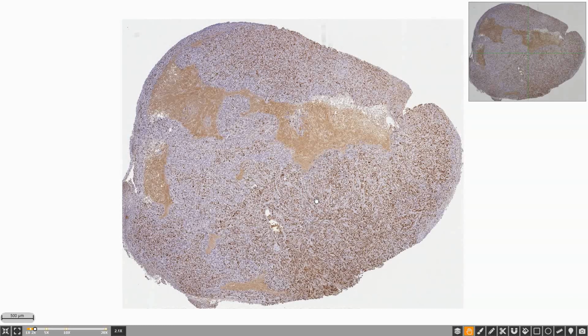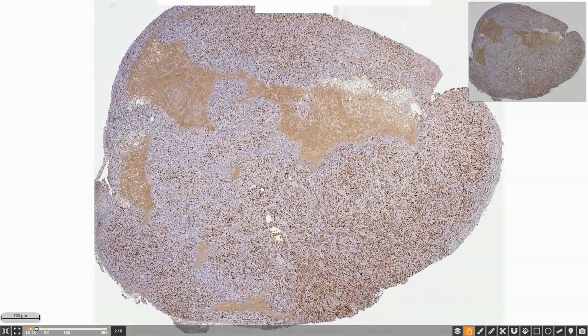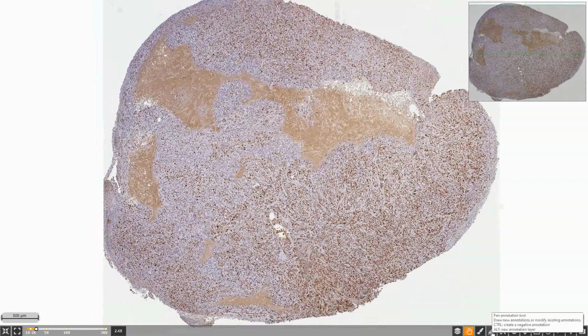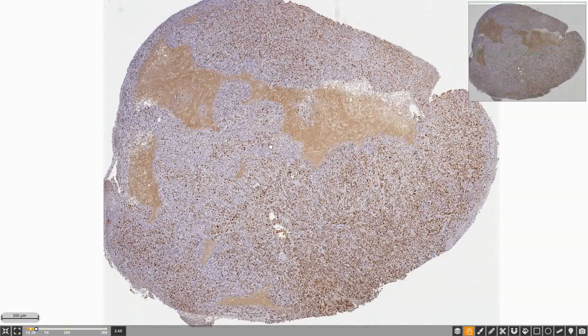That's number one. Number two is probably the use of dual monitors. If you want to drag the images to a different monitor, you can have the Halo interface in one monitor and the image open in a separate monitor, so you get the most use of the available screen space. And number three is that you'll notice the annotation tools go with you when you move the image. So if you want to focus on selecting regions of interest, you can use these tools down here without the rest of the Halo interface in the way. That's a couple of things we'll come to in more detail later, specifically annotations. But just be aware that if you want to move images into full screen, it may make things easier. So let's just reset that.